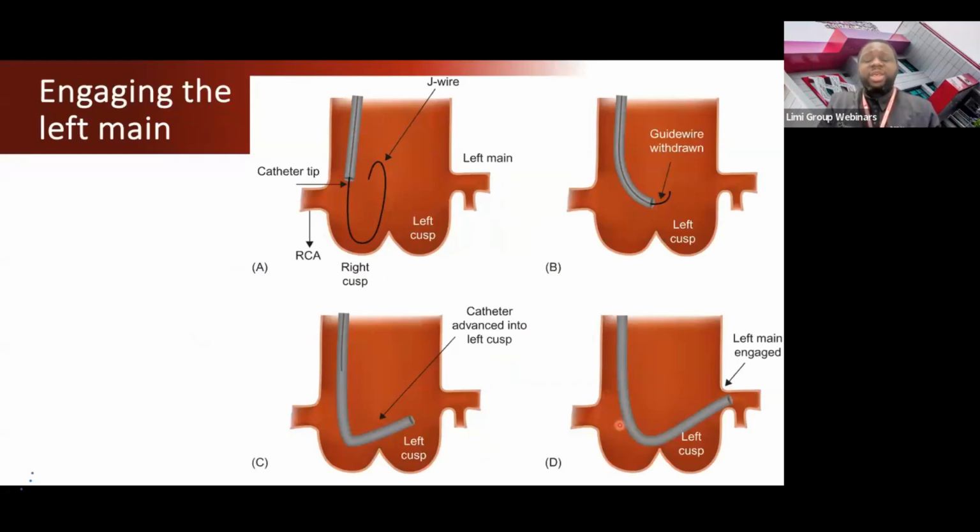These catheters are specially designed by different people who have made plenty of money, I'm sure, from their special designs, so that they just come and sit down here and they just go straight if you have the correct size. Now, sometimes it might not reach or it might be too long, so you might have to change the size, but ab initio, we typically have a way of sizing for most patients to get the appropriate size. So it sits down here and is able to get in.